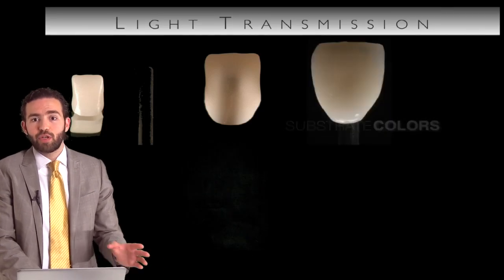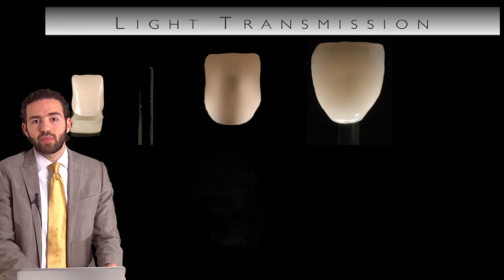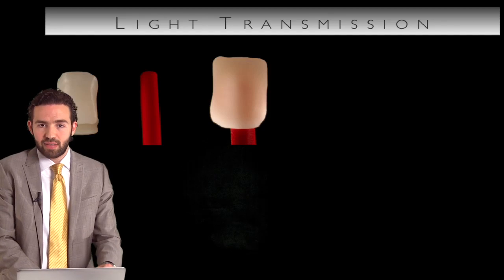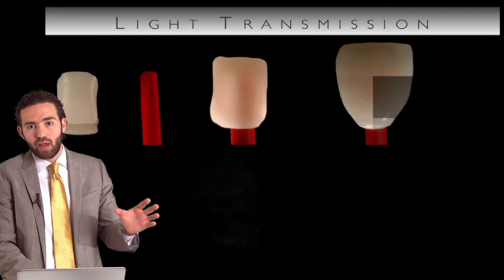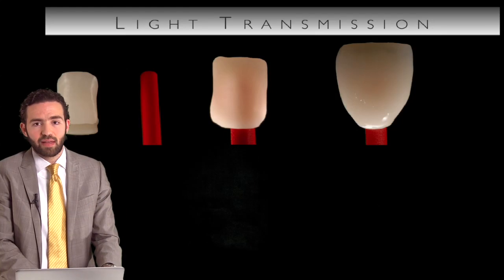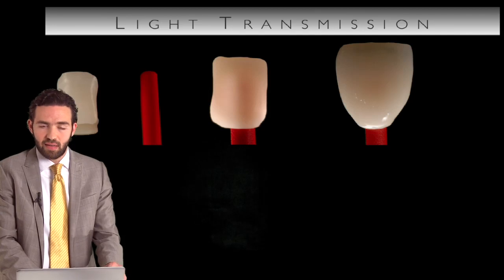And even when you layer porcelain on top of it, you still see the shadow of that black cylinder. We even tried a different color using a red cylinder. We fired some light, and you still see the red through the coping. And after applying the ceramic, this is an actual case on patients with proper space and all that. And you see still in the middle of the crown, you see the outline of the reddish plastic cylinder.